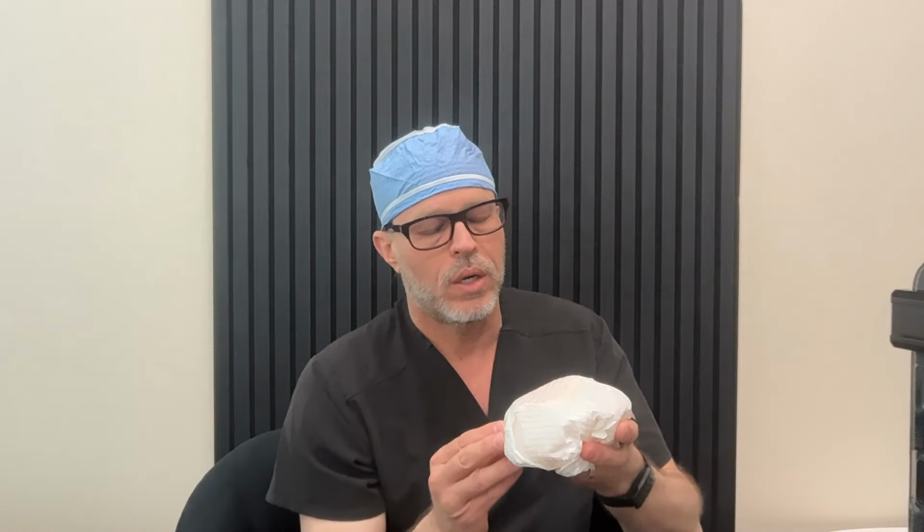We brought props today. So everybody's scar tissue, if we think about it, it normally is fibrous. And for illustration purposes, it's going to be basically white like this. And then when we take that out, we take it out as a whole to the best of our ability. If we can't take it out as a whole intact, we take it out as a complete capsulectomy. What we don't do is leave capsule behind, because I don't want to take something out. And here we're going to just take out the device, and we're going to leave this together.